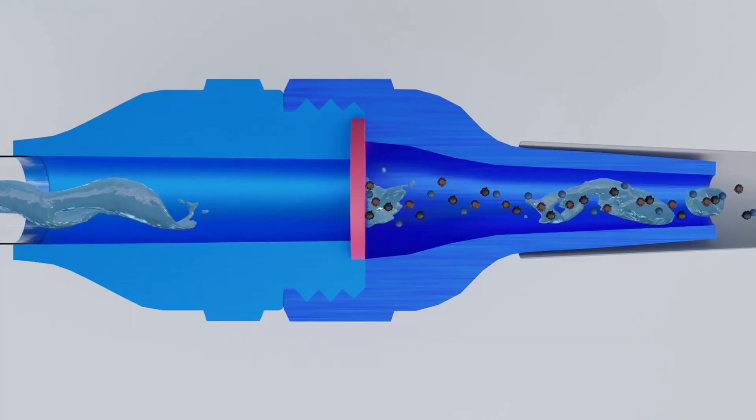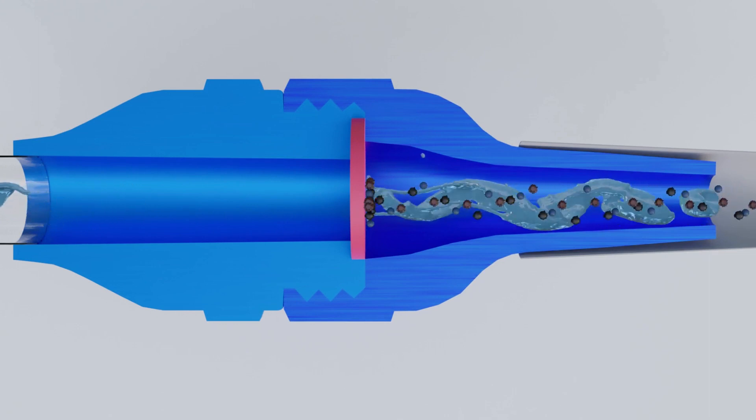However, if the suction is interrupted or blocked at any time, the check valve closes, creating a physical barrier preventing backflow.